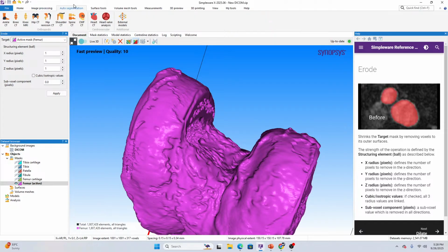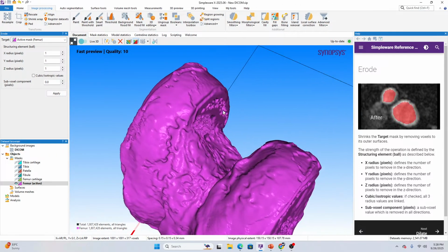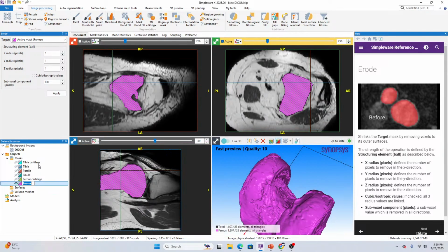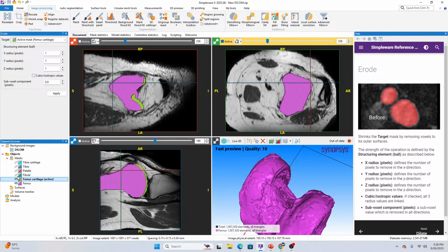I haven't focused much on the auto segmentation part since this webinar was specifically focused on how to optimize the results. Let me take the same knee MRI segmentation and do a manual segmentation for it. Before that, we also have one more new feature in this latest release. We can always create a new folder, which helps us label each and every part and clear out our GUI, whichever part we're working on.